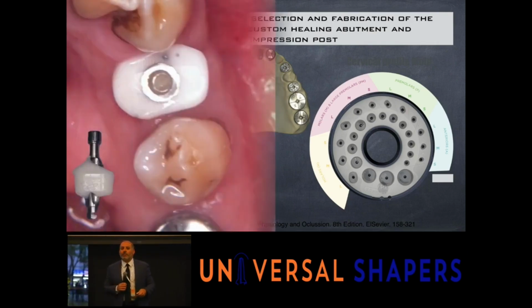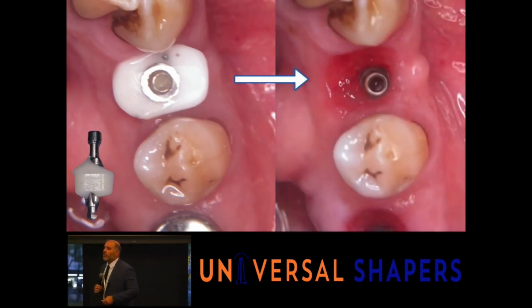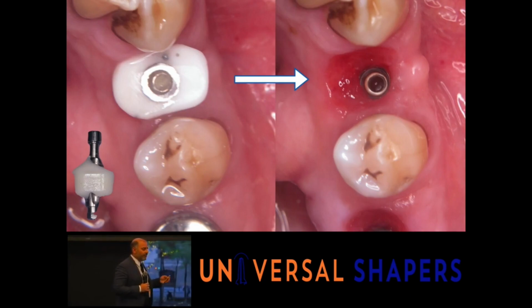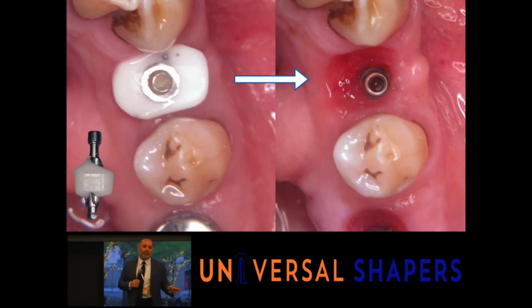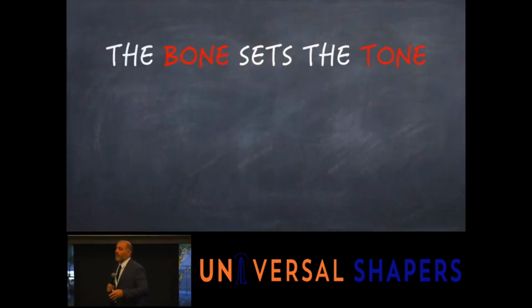But these can be really wonderful. We can use them. They can be tooth-colored. This is one of the first cases I did. But you can see from here to here, we're trying to capture what would look almost like a temporary crown. So we start to develop that soft tissue. And you can do this without these systems. You can also just flow composite yourself, then add to it and customize it. This just makes it a little bit easier and faster. If you're in a high volume production office like mine, time is your most important factor. So if I'm going to spend a little money on a nice kit, but it's going to save me time in the chair, I choose to use those things. But that's not for everybody, and we understand that that may be the case. So you can always make it on your own.